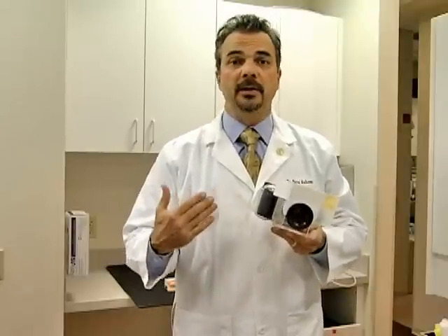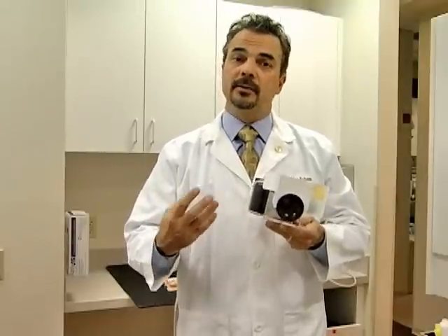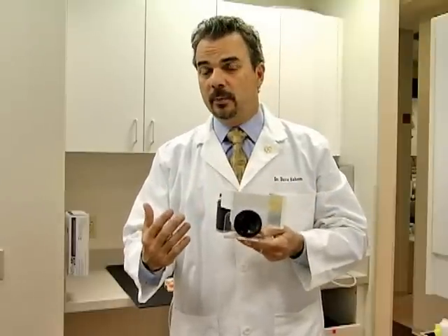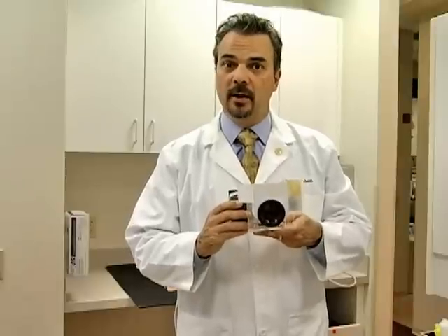It also helps the patient explain to me if there are any cosmetic issues they might have. And it helps me explain to the patient if they might be grinding their teeth, wearing their teeth prematurely, or if their gums are not very healthy. So we take these digital extraoral pictures with every exam that we do in our office.